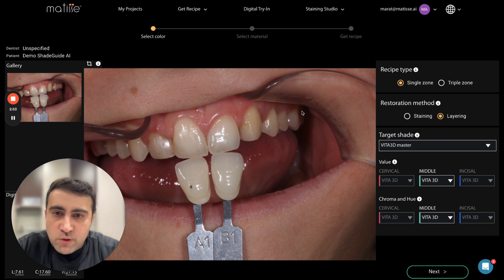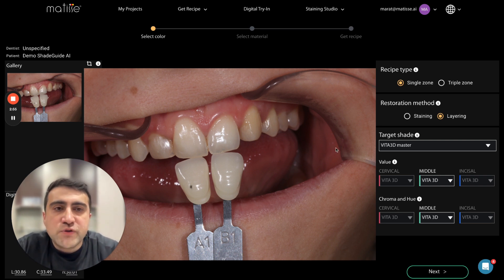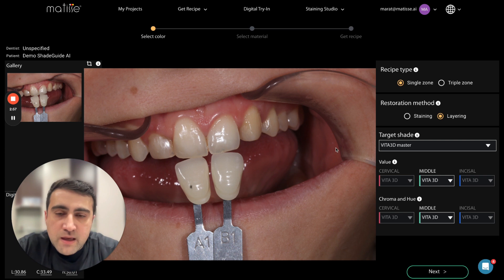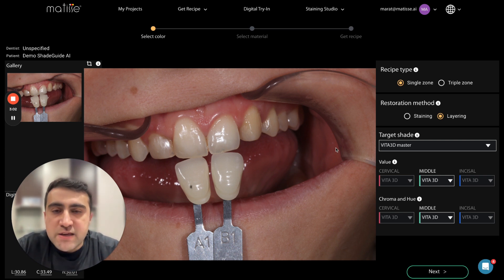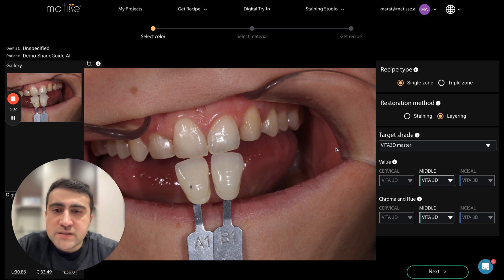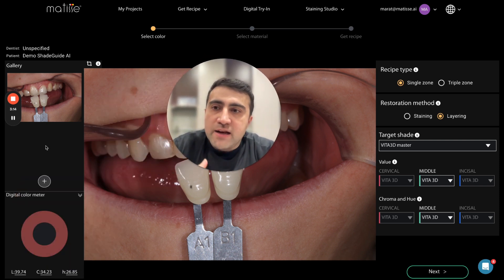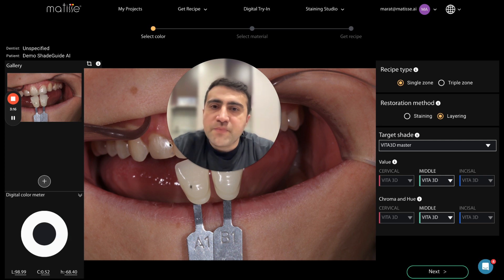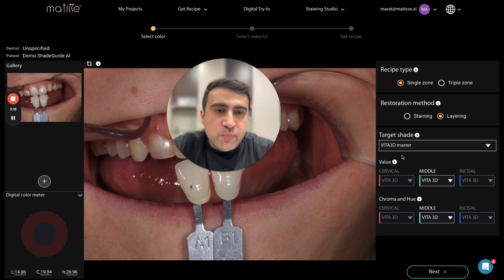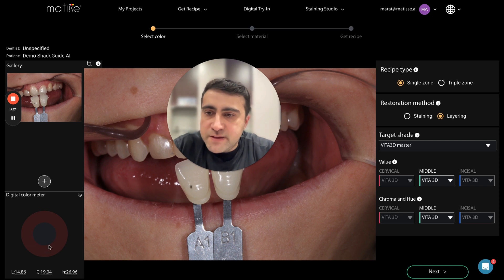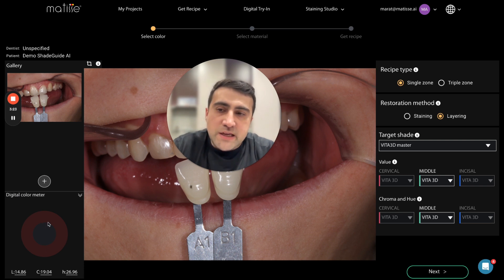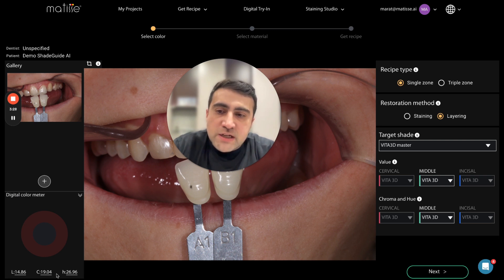In this page, in order to generate a recipe we have to fill out some inputs, because we need to know what you are trying to achieve — do you want to do layering, do you want to do staining? On the left side you have your gallery where you can add more pictures. On the right side are the inputs, and on the left corner is the digital color meter, which represents luminosity, chroma, and hue.